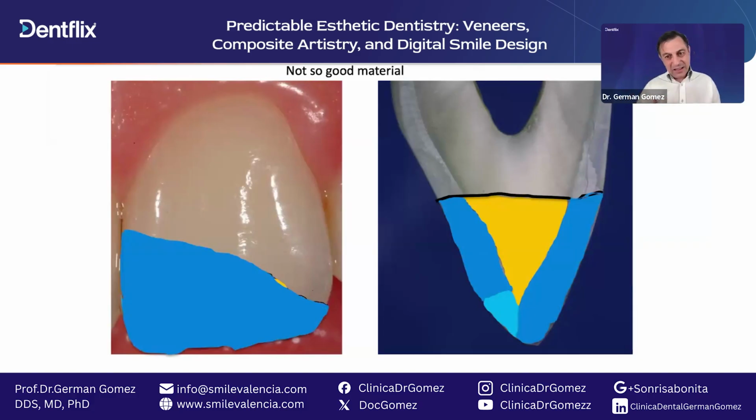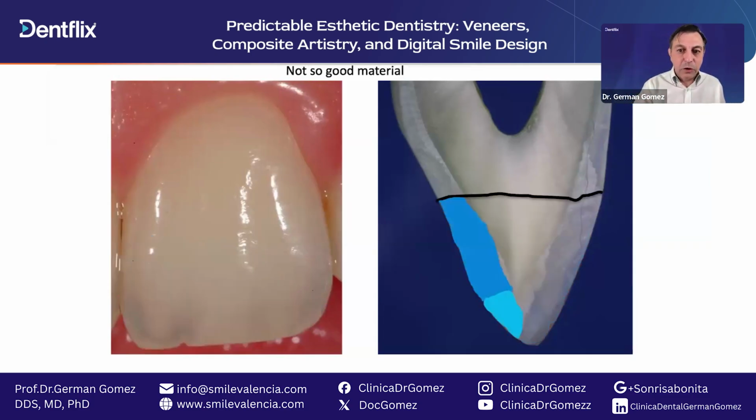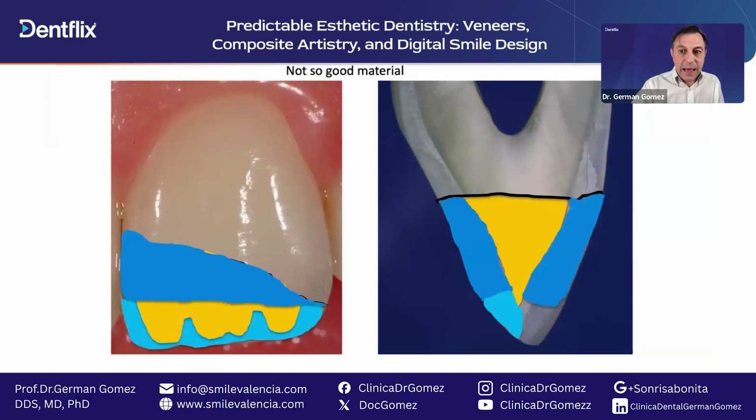Now, if this constellation does not give us enough translucency in the incisal edge, we can use enamel and transparent on the back, dentin, and then enamel here, or all transparent, dentin, and then enamel, or enamel and transparent, dentin, enamel and transparent, to give the incisal edge much more translucency.